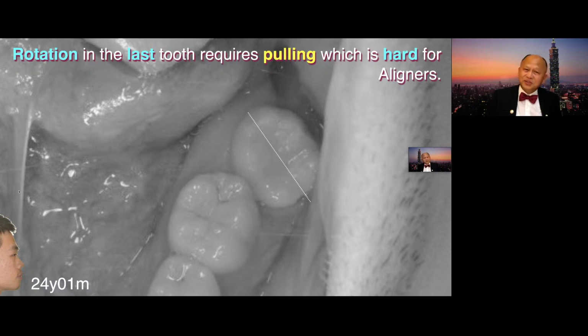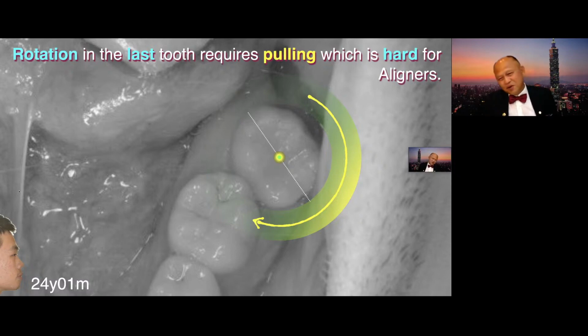Rotation in the last tooth requires pulling, which is hard for an aligner. So we need this moment. Can you tell me how the aligner can execute this moment? And the crown is very short, probably only 2 or 3 millimeters.